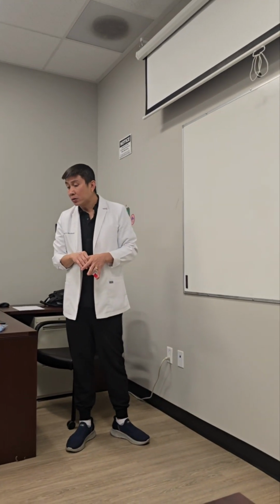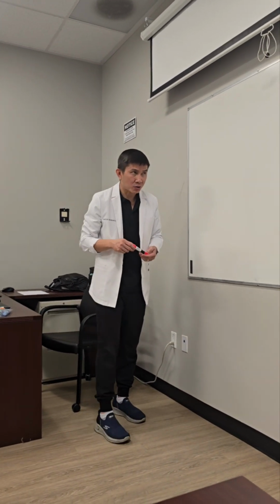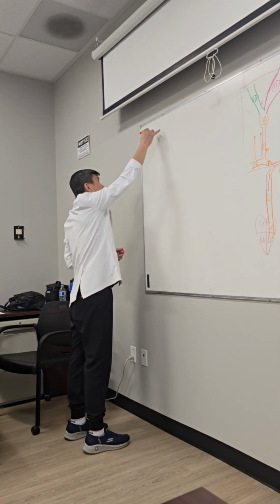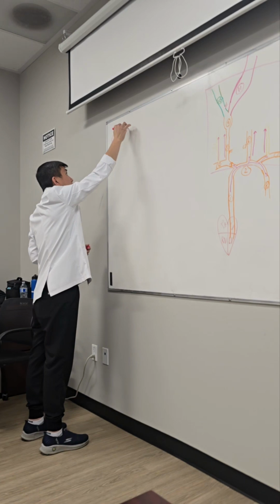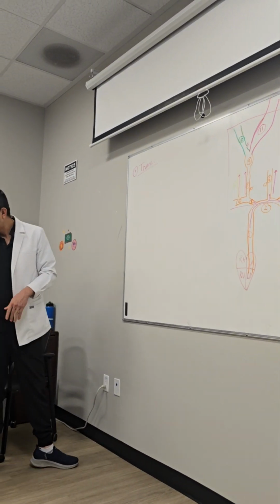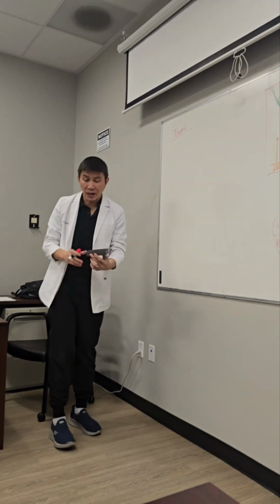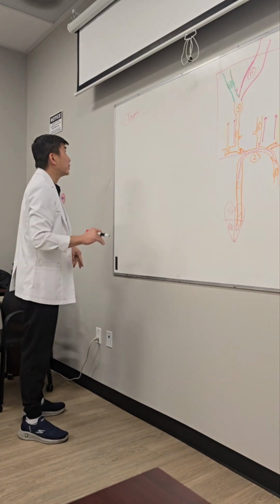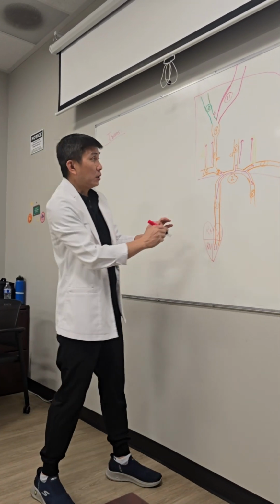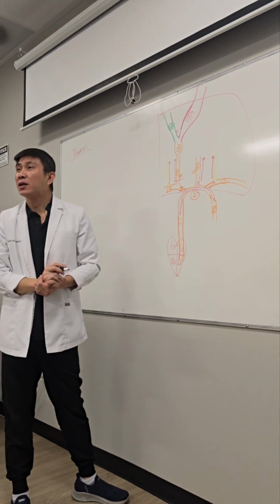All right, so I'm assuming you want to follow my strategy. First, we're going to scan transverse. This protocol is long and has a lot of new ideas, so that's why I did two different parts. For the transverse, you're going to scan here, it's proximal.